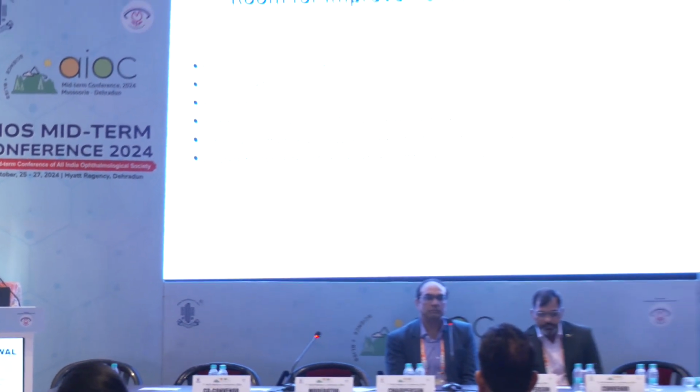Nowadays, the goal of surgery has changed from good visual outcome to good refractive outcome. So that is actually where the role of good IOL power calculation comes in. According to this study in 2017, there's still room for improvement, as most surgeons even nowadays are able to achieve the target of 0.5 diopter in mostly 80% of the cases, and less than 2% of surgeons are able to achieve a target of more than 92%. So with newer methods, this target of 90% is still achievable.